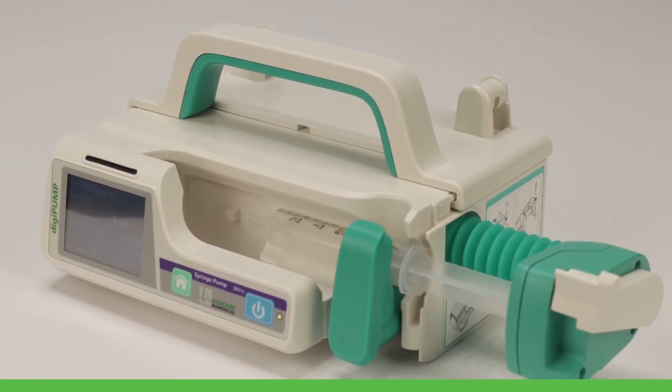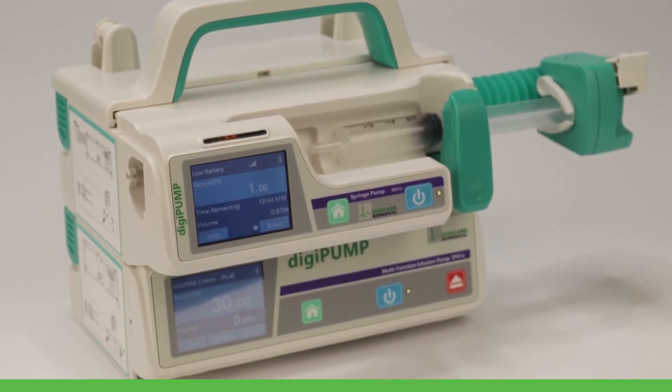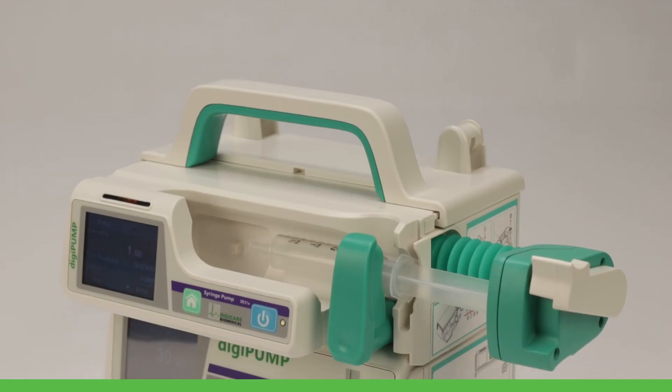The DigiPump features a space-saving modular design allowing units to be stacked, attached to an IV pole, or even hung from kennel doors.